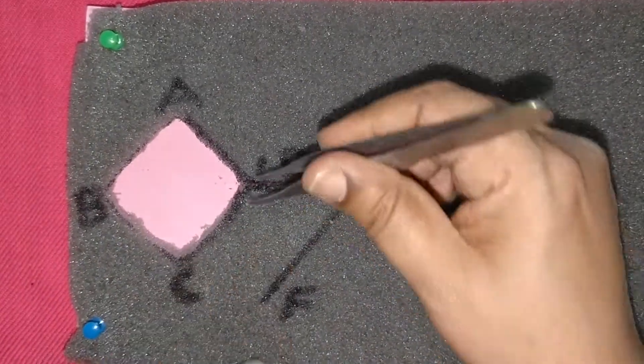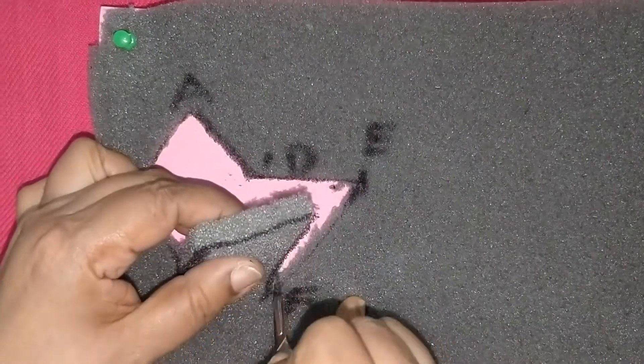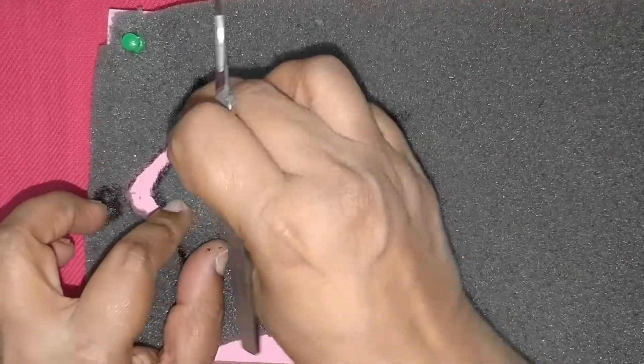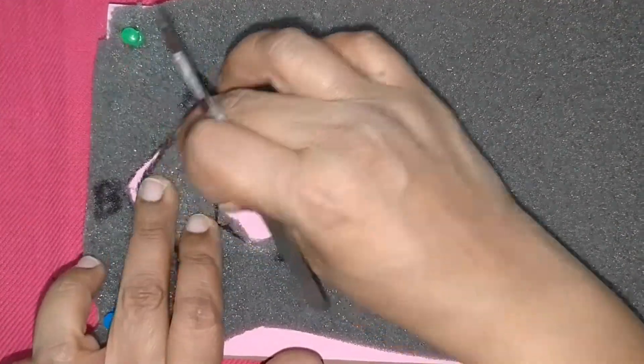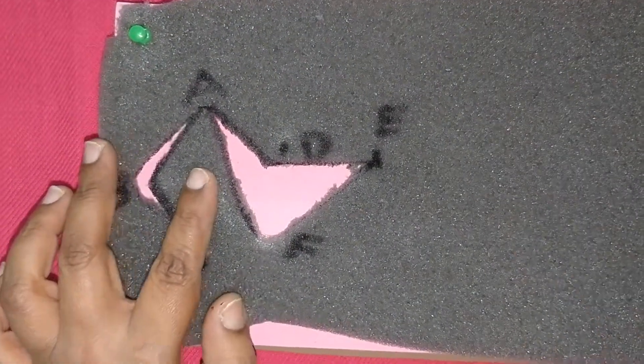Now the flap has been raised up to the pivot point F. Now this flap must be transposed. When we are transposing this flap, the important thing is to make sure that the incision goes right down to the pivot point.